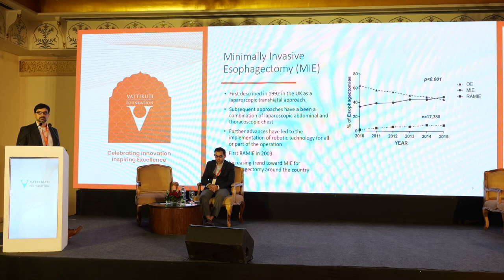Minimally invasive esophagectomy, this is a 10-year-old study, so you can imagine that bottom graph is continuing to rise as time is going on. Minimally invasive esophagectomy has been done for quite some time, but the robotic platform has allowed it to move forward significantly.